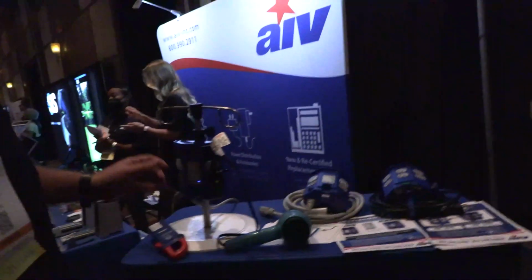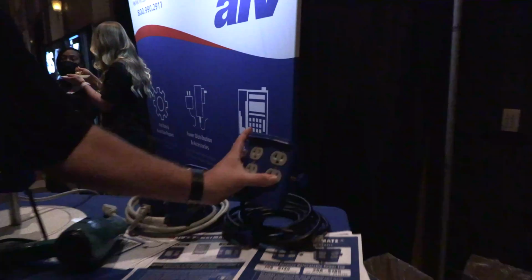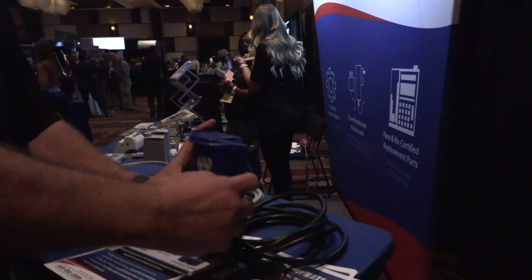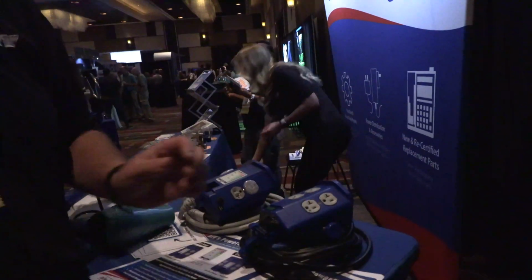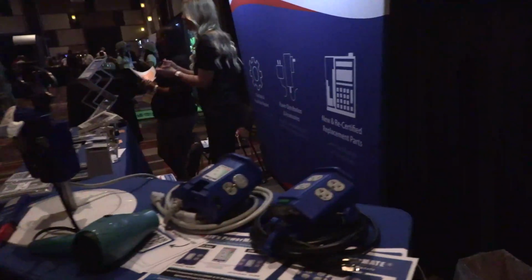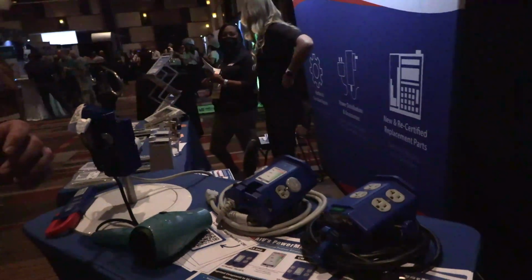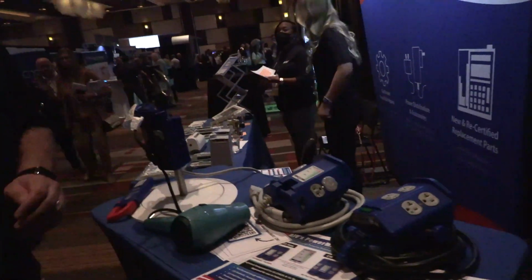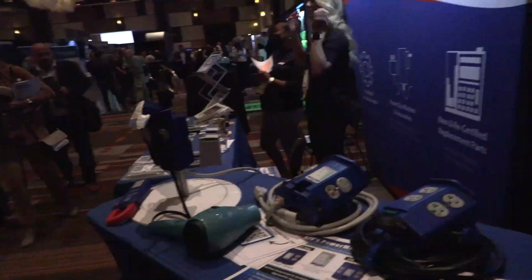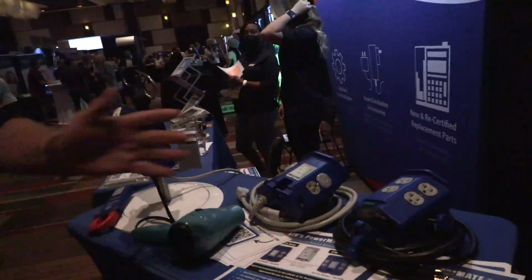The other thing that was always open to interpretation is we designed our old version with a thumb screw, so you could put it onto an IV pole, and then there's a locking nut that you could take a tool to permanently affix it, because that's the terminology. Now there's questions, and they're saying if you have a tool, somebody could potentially undo it. I think it now just says that it has to be affixed. But the definition of affixed is open to interpretation, and some inspectors are saying that doesn't work anymore.